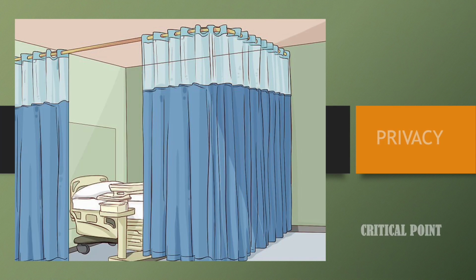Provide a bedpan if female, or provide a urinal jug if male, for the patient to collect urine inside. Assist if the patient is not able to do that by themselves. Allow those who can walk to go to the sluice room to collect urine. Make sure that you screen the patient to allow privacy. This is part of the critical points.